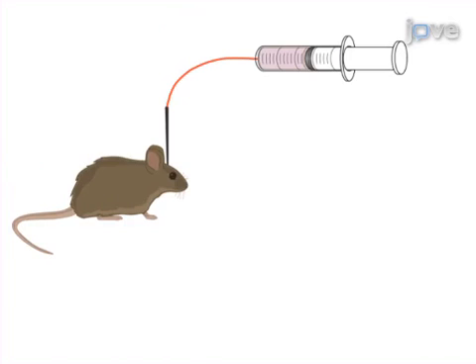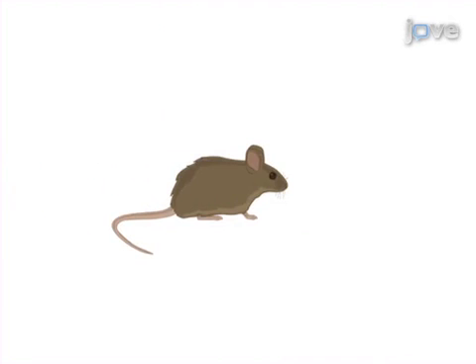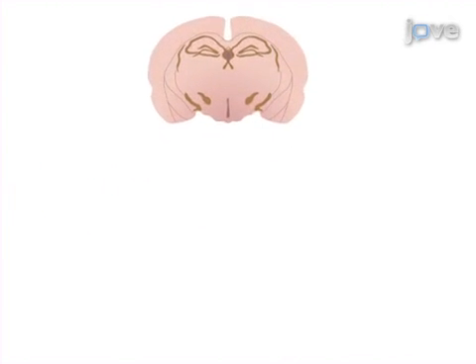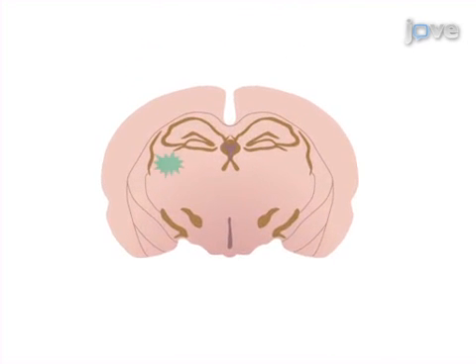This is accomplished by first injecting the virus into the mouse striatum. Then the mouse is allowed to recover for 2 to 3 weeks following surgery. Next, the mouse is sacrificed and acute brain slices are prepared. The final step is to perform confocal calcium imaging of the brain slices.